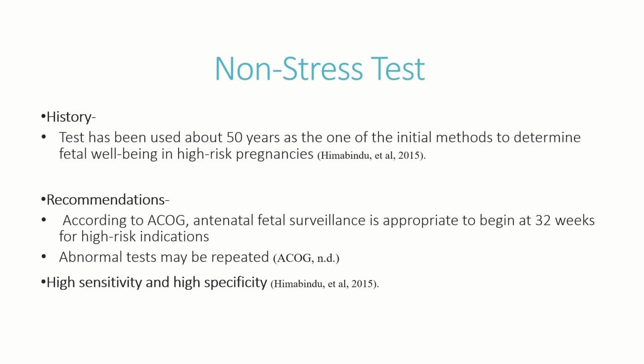It is also recommended that abnormal results may be repeated depending on the specific indication and the provider's clinical judgment. Then additional fetal surveillance testing that is more invasive will take place. Since the test is fairly basic and the results are considered just normal or abnormal, this test has a fairly high sensitivity and high specificity.